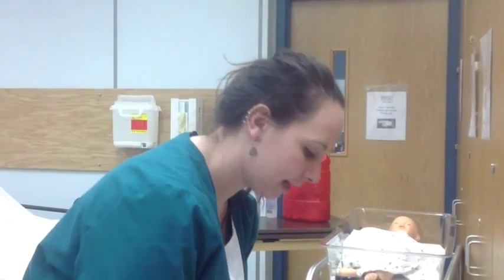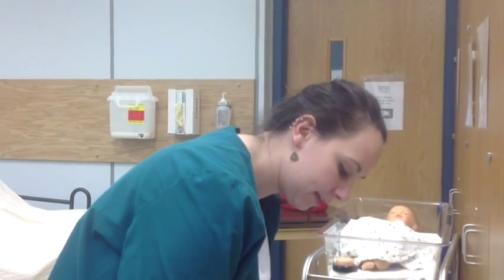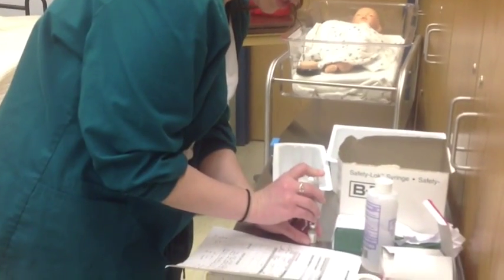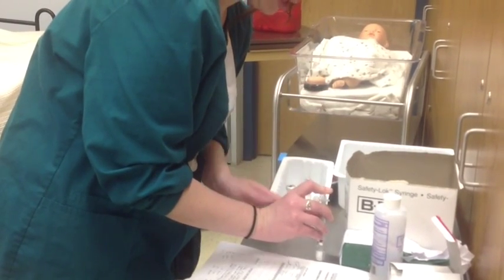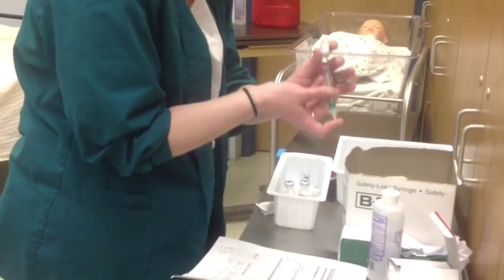I'm going to pull the safety back. I'm going to put it into the vial, face down. I'm going to push the plunger in to inject the air into the vial. Now, you're going to hold the plunger because the air can come back up, and some medications you can't push it back in. So I'm then going to flip it.